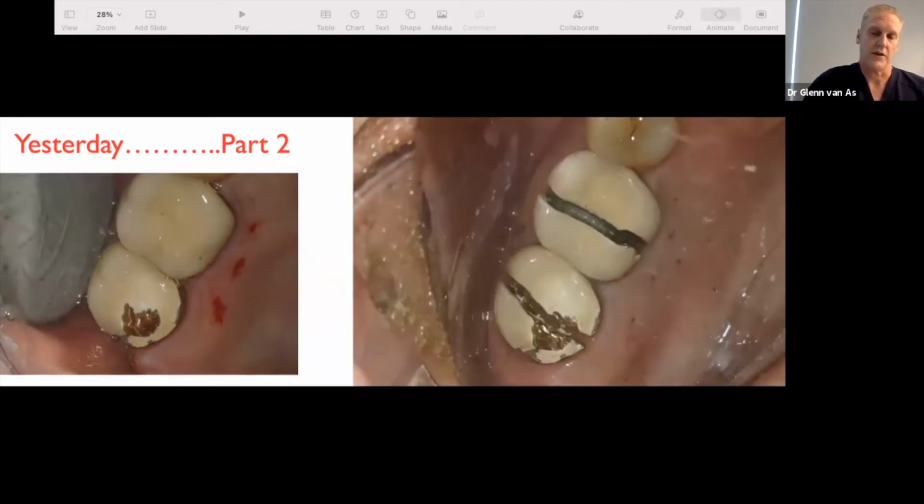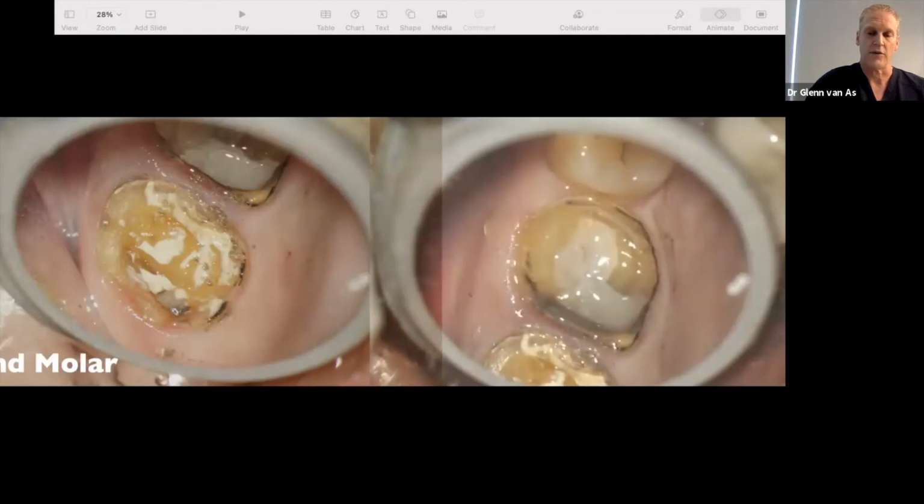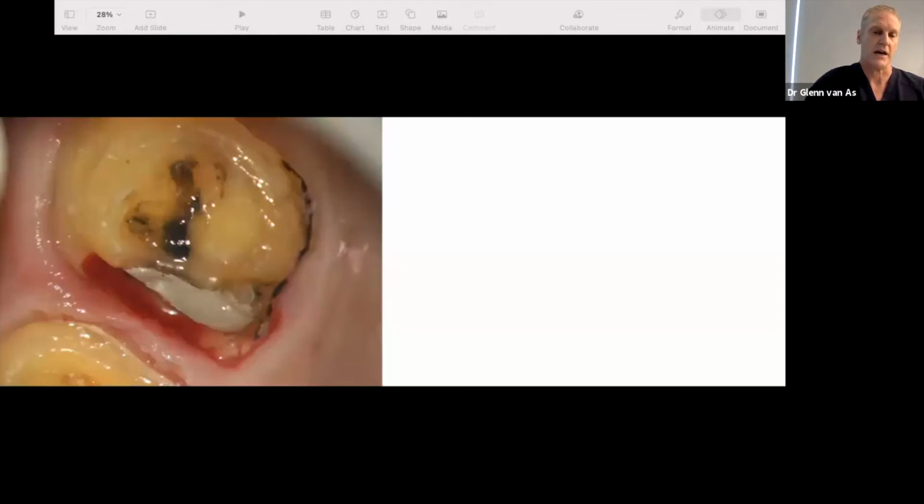So we sectioned the crowns, and when I sectioned the crowns there, I always thought that the gold was going to be a little thin on the posterior crown, the second molar, but indeed it was not. And when I removed the crown off the second molar, you can see there isn't a lot of tooth structure left, but it was the tissue in between the first and second molar that was of concern to me, because as you'll see, the margin on the distal of the first molar is quite deep, and actually it's on resin, and I had to go and clean it up.